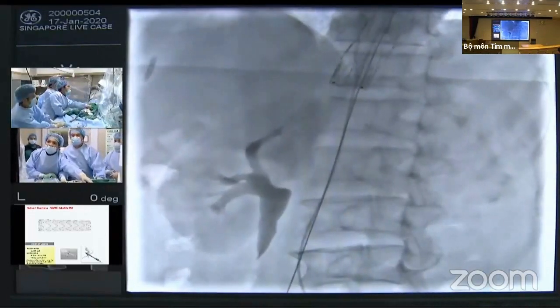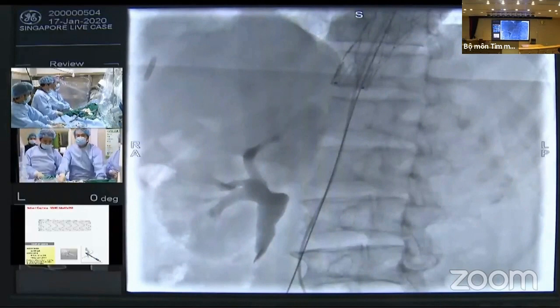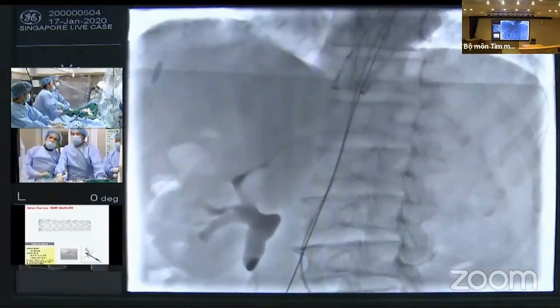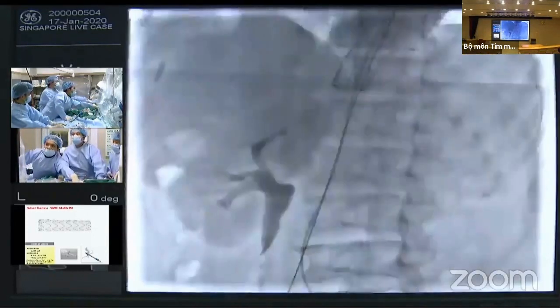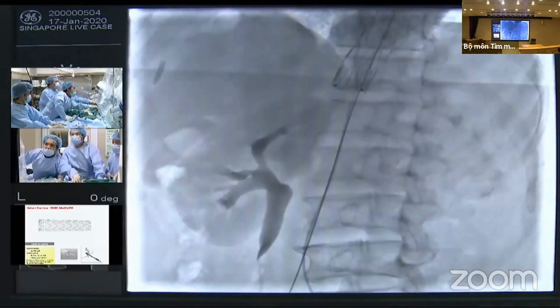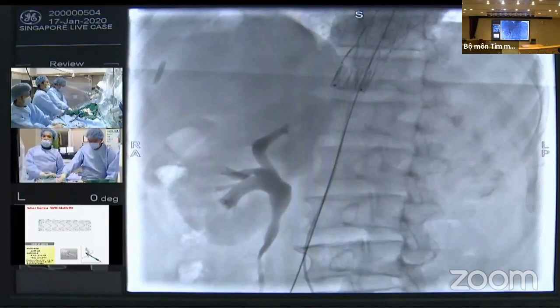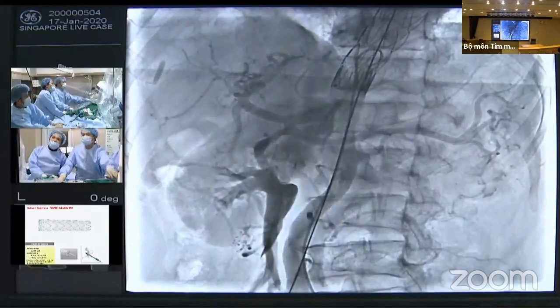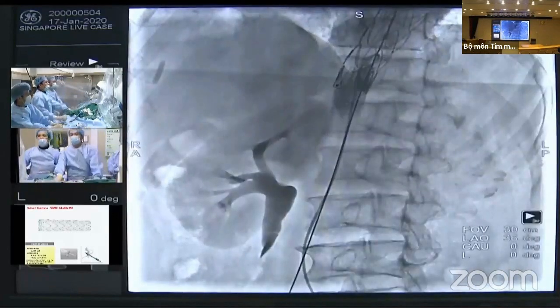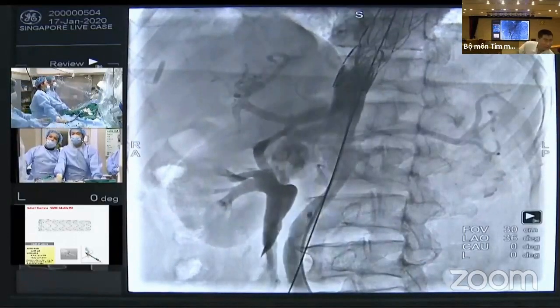So, Dr. Saifu, what do you do for the distal part of the lesion? Yeah, I believe they would have measured the diameter closely, and I agree if you don't measure it properly, it might cause problems later on. I've had an experience whereby we used the Cook and a bare stent below that, and we had a retrograde flow from the false lumen, and that really is troublesome because it becomes very huge in the thoracic cavity.